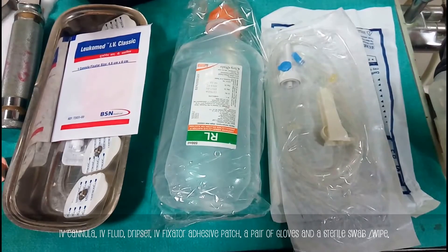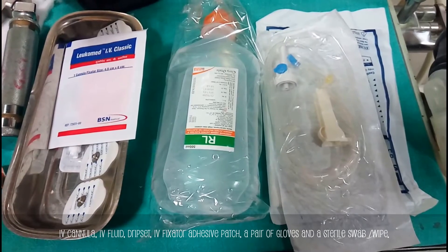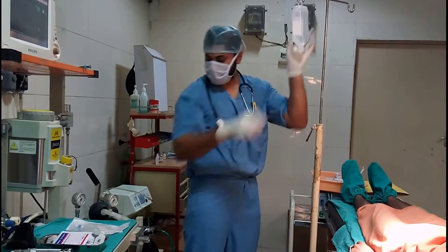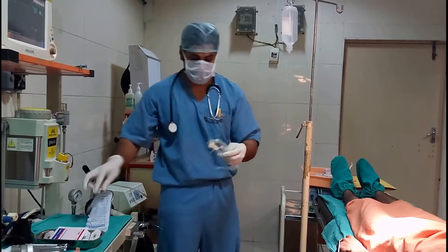Today we are going to learn how to fix an IV line. These are some of the things that you require prior to IV cannulation. Break open the set and hook it up, collect your IV line and make sure there is no air in it.